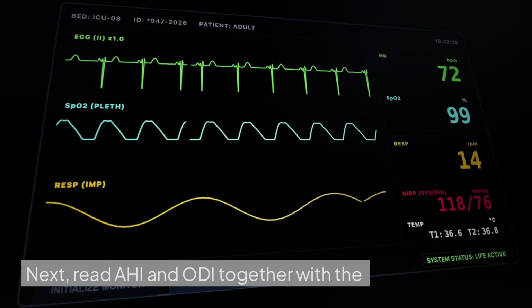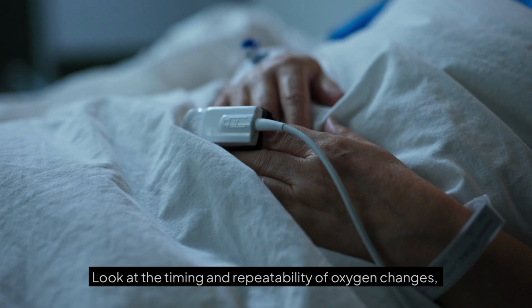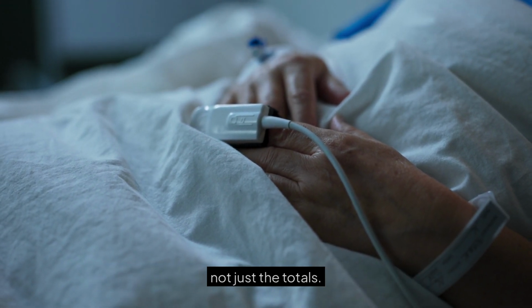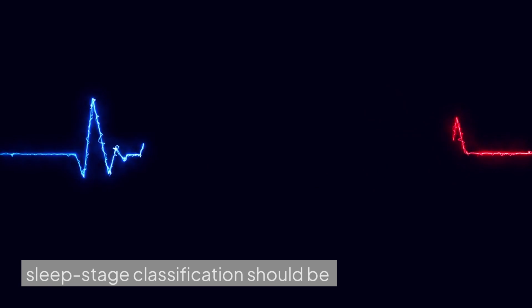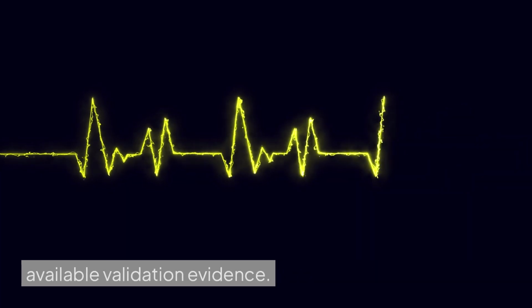Next, read AHI and ODI together with the SpO2 trace. Look at the timing and repeatability of oxygen changes, not just the totals. Perfusion index can provide supporting context about pulse signal strength, while sleep stage classification should be treated as device-dependent and reviewed against the algorithm, intended use, and available validation evidence.